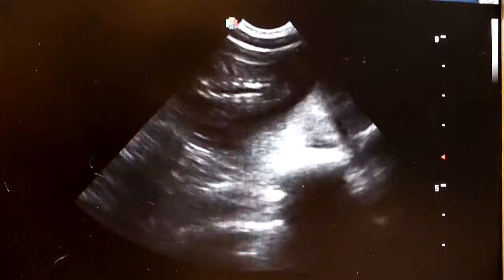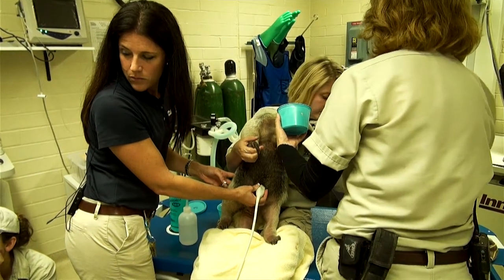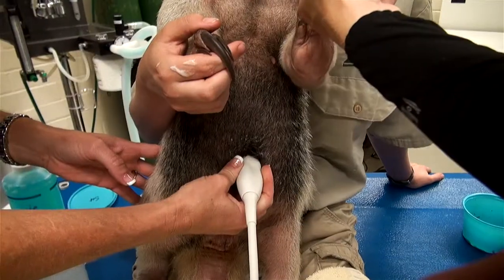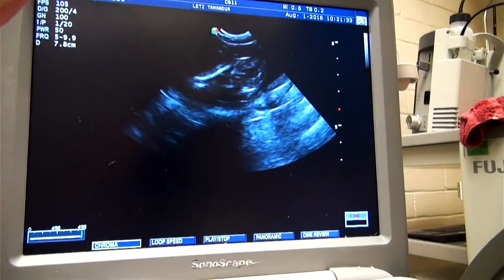So the baby looks great so far, but she'll generally tolerate a good 4 to 5 minutes or so, allowing us to get the measurements that we need, make sure that the baby has a strong heartbeat and that the baby's nice and active. That's a profile of the baby's head, so that looks exactly like a tamandua head.